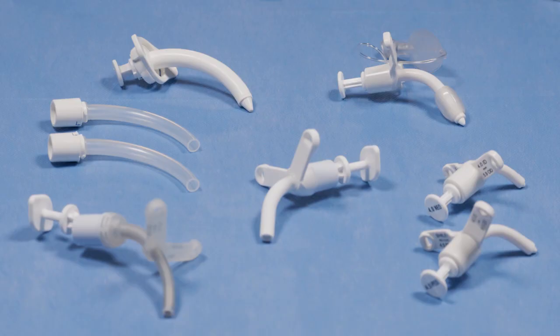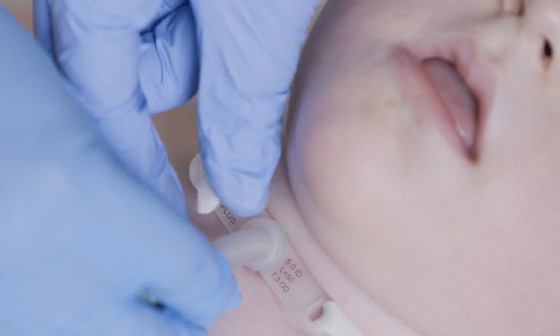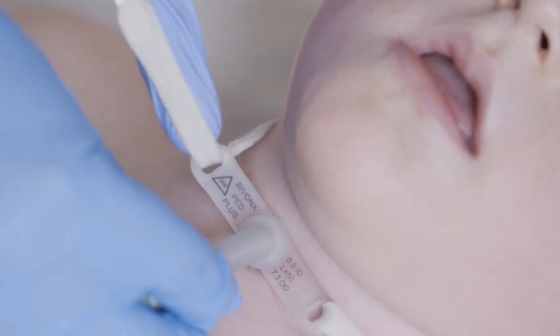For children, there are quite a few different tracheostomy tubes. The main variation is we have neonatal ones and paediatric ones. The paediatric tubes tend to be a little bit longer, but the similarity is the diameter. They range from 2.5 millimetres in diameter and go all the way up to 6.5 millimetres, and they come in different types.